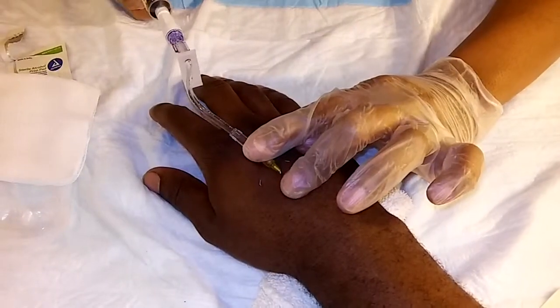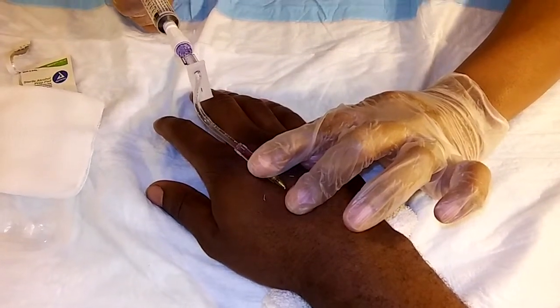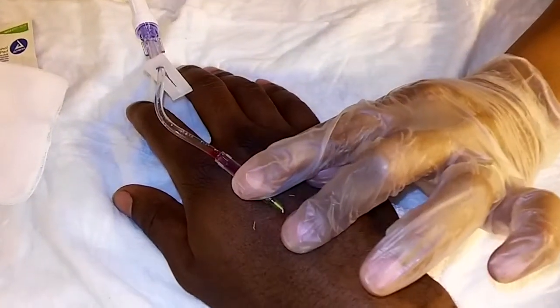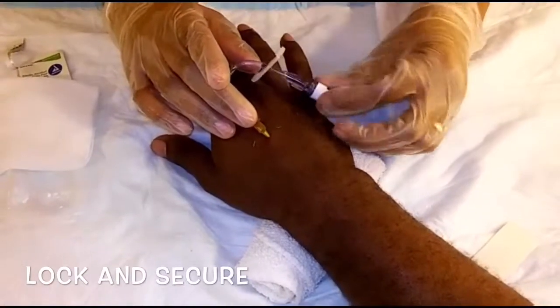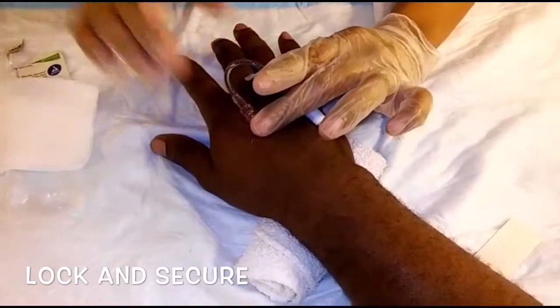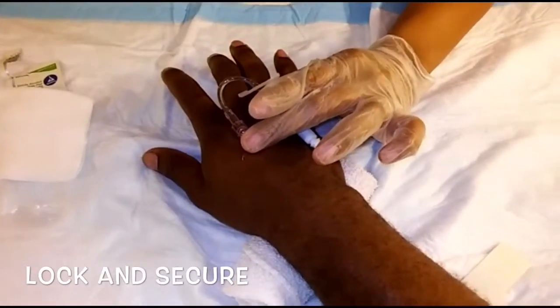To confirm placement in the vein, I'm going to pull back on the plunger and I see the return. Lock your extension set and now it's time to secure it to the arm.